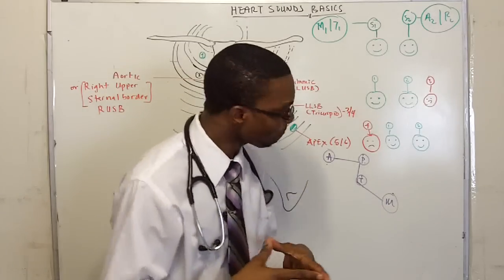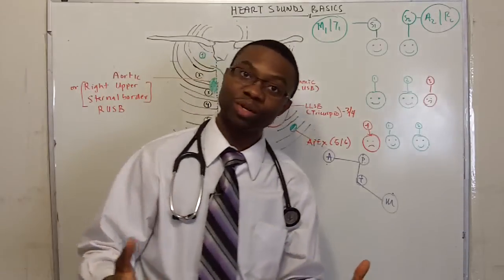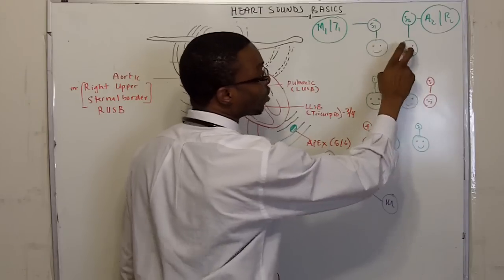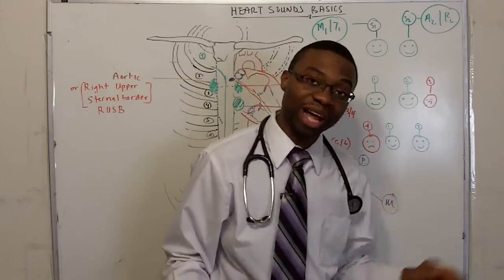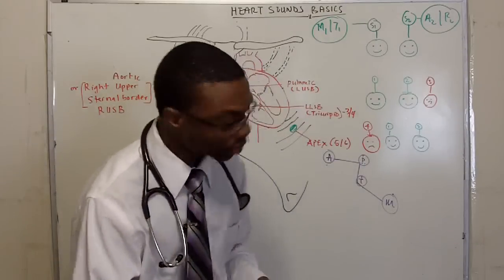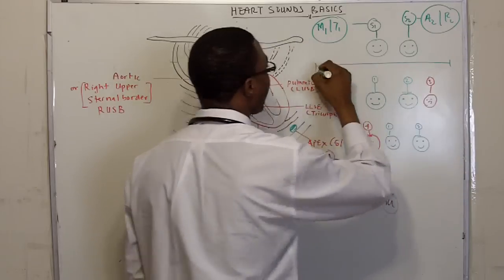Now, if we go down here, now that we have learned how to listen to S1 and S2, remember? One, two. One, two. Because when I go to another pathology, now you're going to be like, what? I didn't hear that. Okay, we'll find out. So now that we know the normal, this is normal, and everybody's happy.